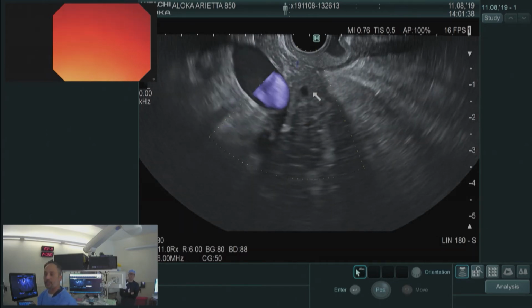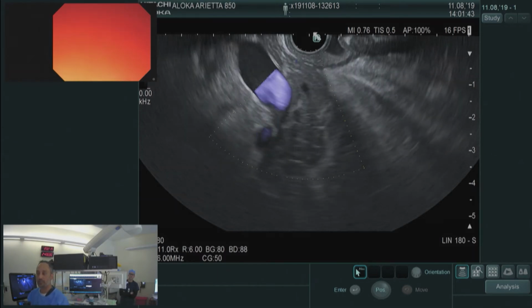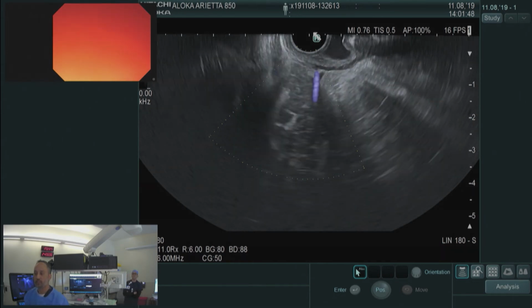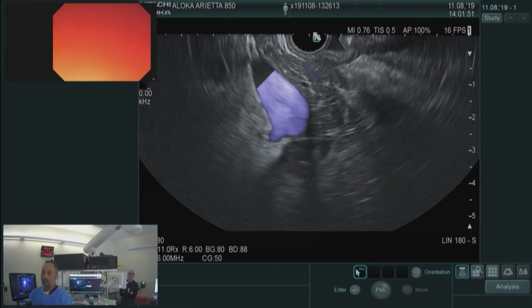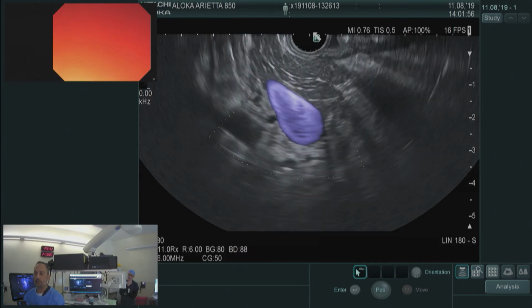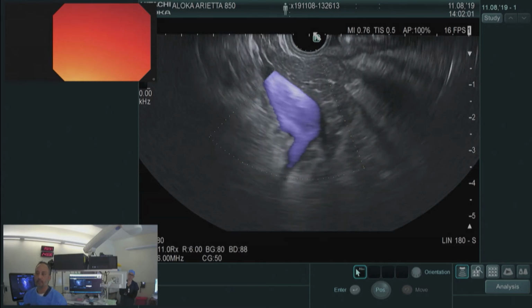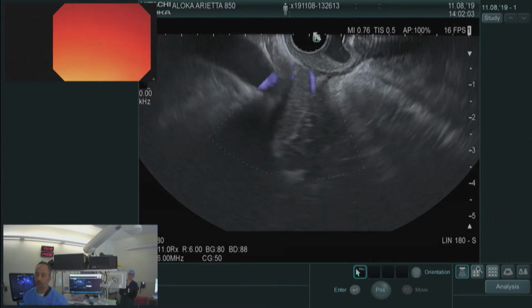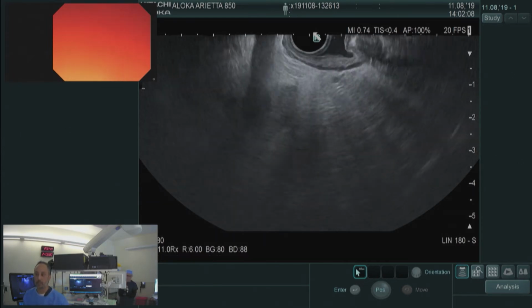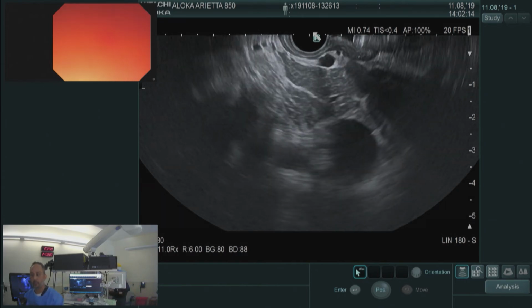Now, this guy carries a diagnosis of idiopathic recurrent pancreatitis, documented multiple episodes over the last several years. They did the standard workup, have not found an etiology. So there's the head of our pancreas. For the endosonographers in the room, you can see that we have some hyperechoic stranding, almost some subtle lobularity developing here, but no duct dilation. This can oftentimes just be seen with resolving acute pancreatitis, chronic pancreatitis, and sometimes even with autoimmune pancreatitis, we get that very dark, hypoechoic, lobular-looking pancreas.